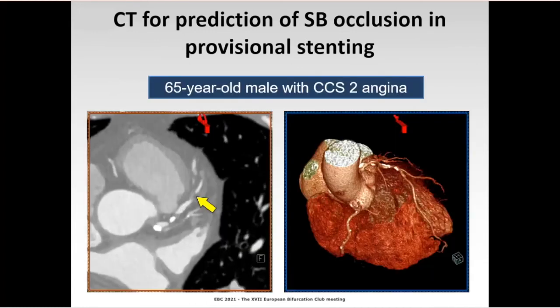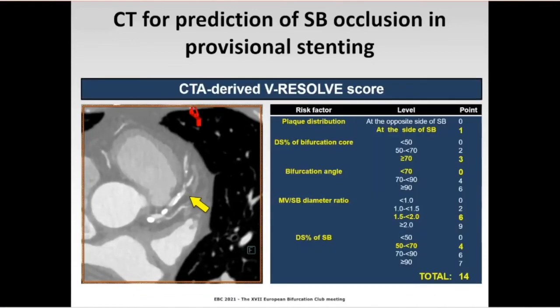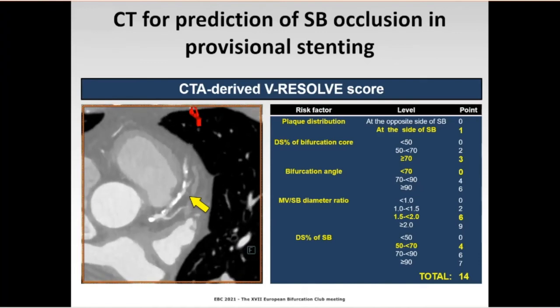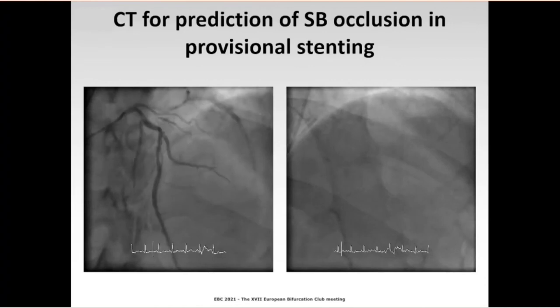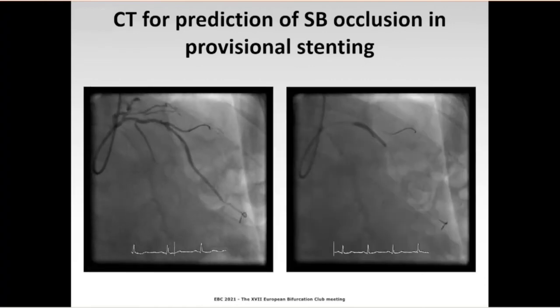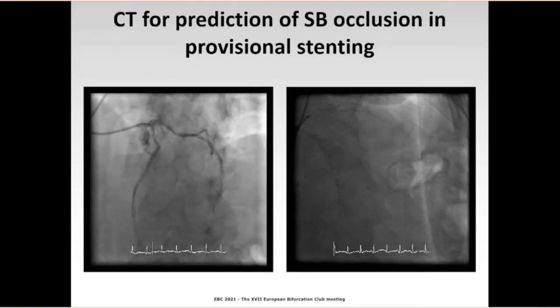Here you can see an example of an LAD-diagonal branch bifurcation lesion on coronary CT that clearly displays plaque characteristics as well as the bifurcation angle. Importantly, the total CT-derived Resolve Score was remarkably high, summing up the distribution of plaque at the site of the side branch, the stenosis of both the main vessel and the side branch, as well as the high main vessel-to-side branch diameter ratio. In addition, we could also see non-calcified low-attenuation plaque at the side-branch ostium, resulting in side-branch occlusion after main vessel stenting, despite the presence of a safety wire in the diagonal branch.